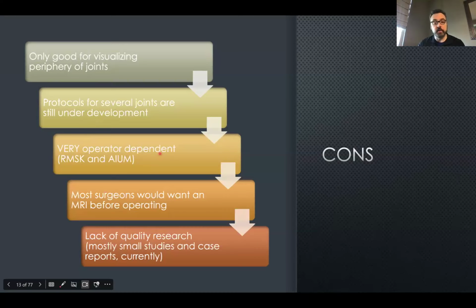I personally would rather do the scan myself and know what I am looking at. And if you ever did get into this as an imaging modality that you would consider using, you'd want to do it yourself to make sure you know exactly what you're looking at and you see how the patient responds, depending upon where that probe is. Or you find an RMSK that you trust to get you good quality images.